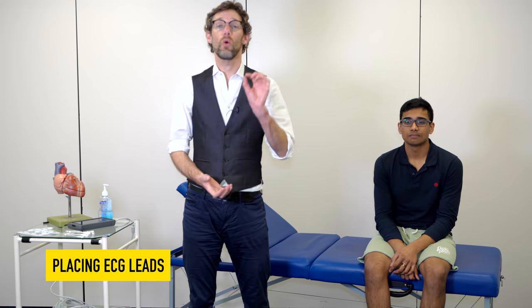Hello and welcome back to the channel. My name is Dr James Gill and today we're going to be looking at the ECG. We've done a demonstration of the ECG before, but today we're going to look specifically about where we're placing the limb leads, but crucially why and how that enables us to view the heart in 12 different directions or 12 different views which we see on the ECG.